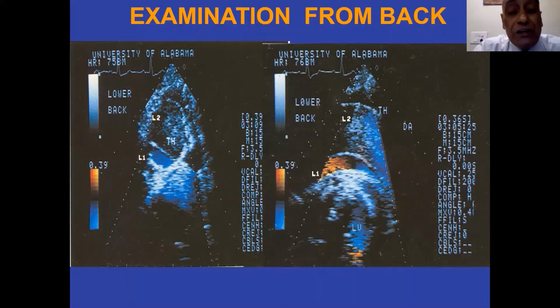As far as the right ventricle is concerned, as I partially said, you make out the morphology from the shape, which is more triangular, but more importantly, you look at the moderator band. The moderator band is a transverse band of muscle, a modified papillary muscle, which goes from the right ventricular free wall to the interventricular septum. That is present in almost every patient, and it identifies the right ventricle in whichever place it is, whether on the right side or the left side.